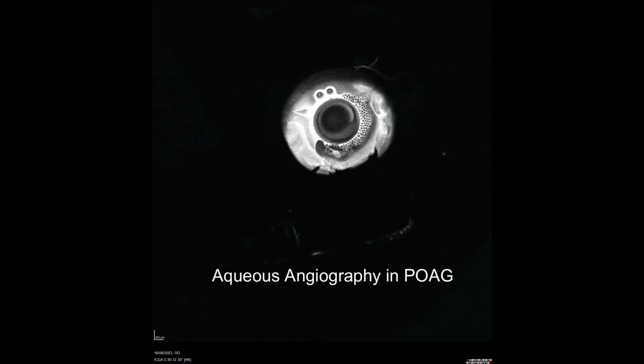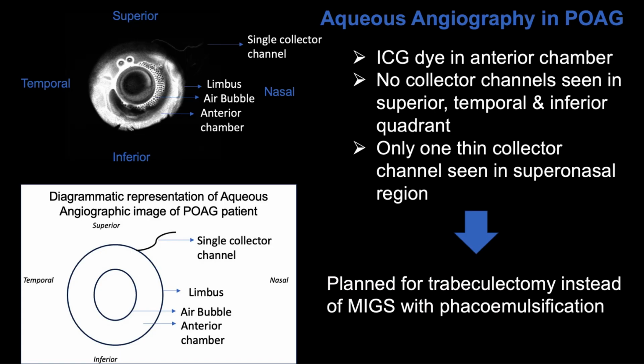Aqueous angiography in this patient. Indocyanine green dye is injected into the anterior chamber and enhancement of the anterior chamber is seen with an air bubble casting the black shadow in the center of the anterior chamber, which is an artifact. A single collector channel is seen in the superonasal quadrant with no collector channel seen in superior, temporal and inferior quadrants. Due to severe lack of aqueous outflow through trabecular meshwork, we planned the patient for trabeculectomy instead of MIGS with phacoemulsification.